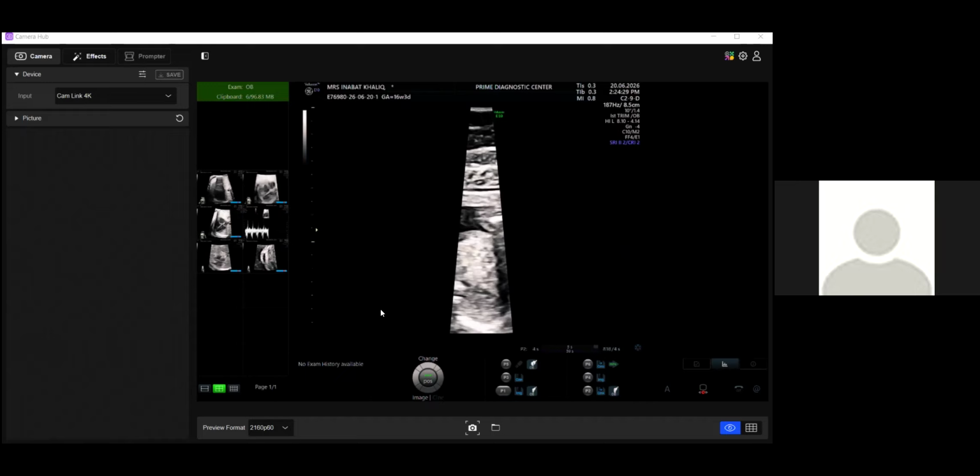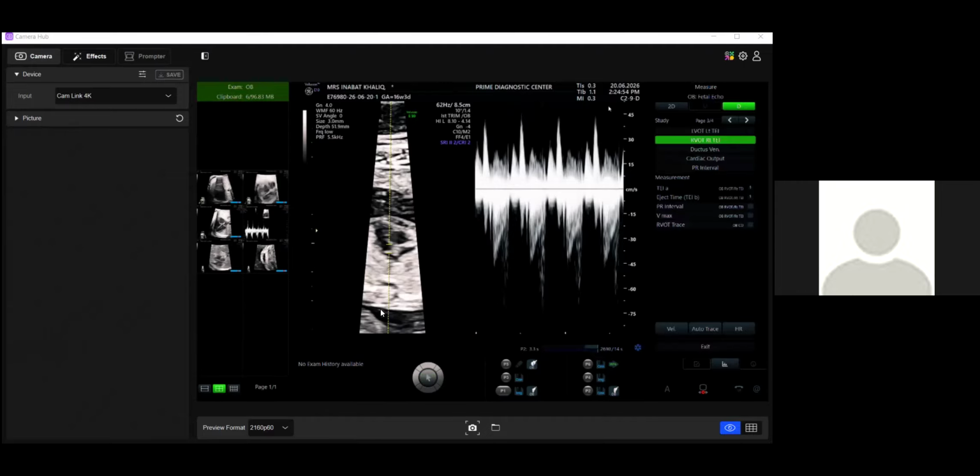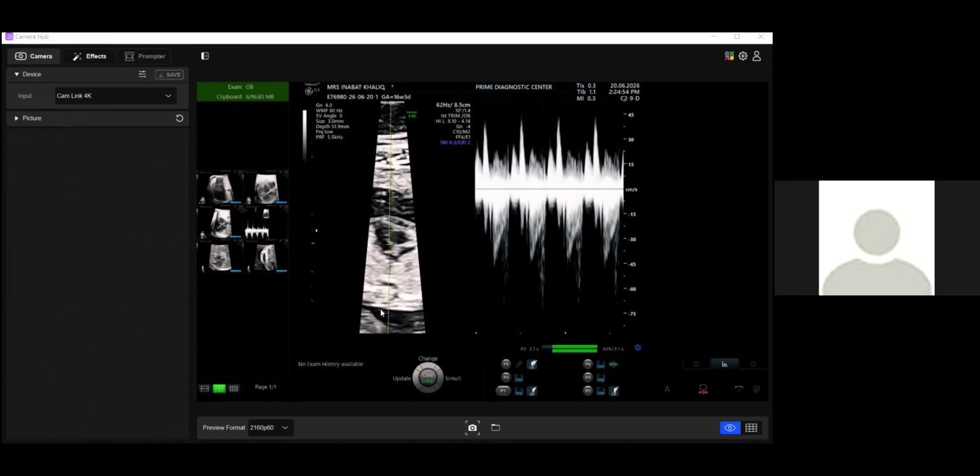104. Okay, we'll check it again here. You done with the other machine? Now we'll do it here again. Okay. Do you have previous babies? No, sir. My first. Okay. Done. Okay, we would do it here.